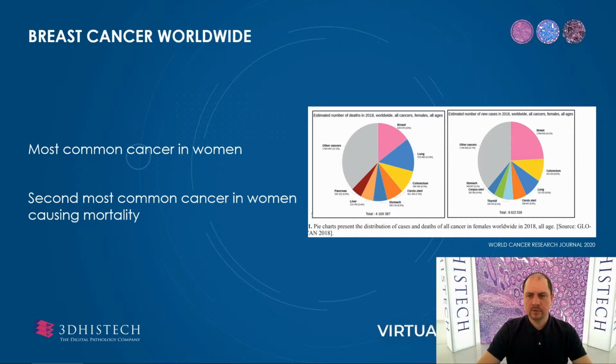First, we focused on image analysis of the breast panel, which is a set of breast tissue slides stained for cancer diagnosis. Why is the breast panel important, you might ask? For that, I created this slide and the next one. Although it is a bit earlier chart from 2018, it is visible that these two statements, that the most common cancer in women is breast cancer, and the second most common cancer in women causing mortality is also this type, are still standing today. This paints a grim picture, but the actual state is somewhat better. Let's look at the next slide.